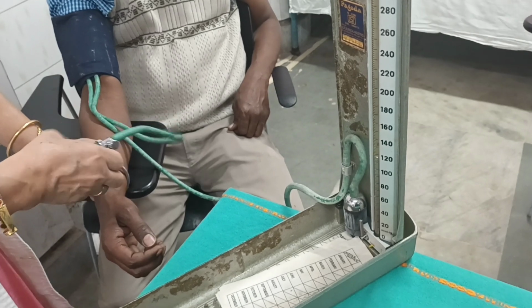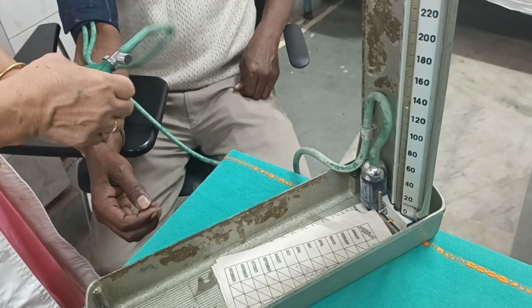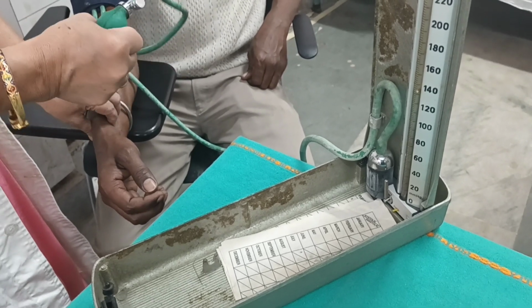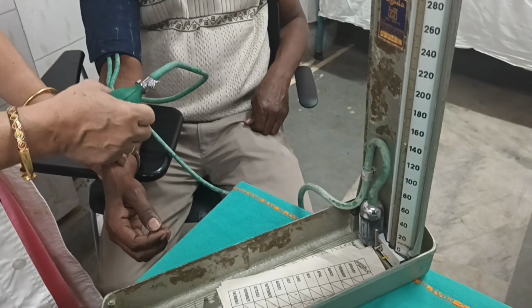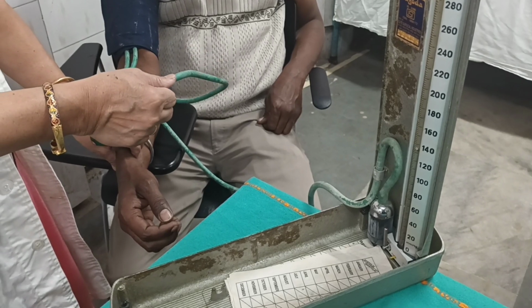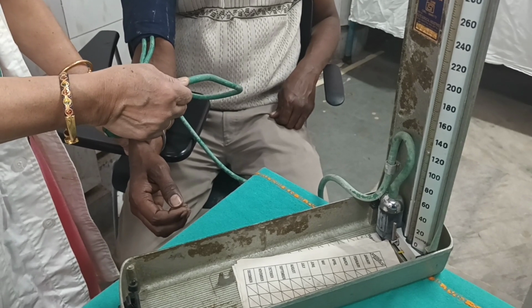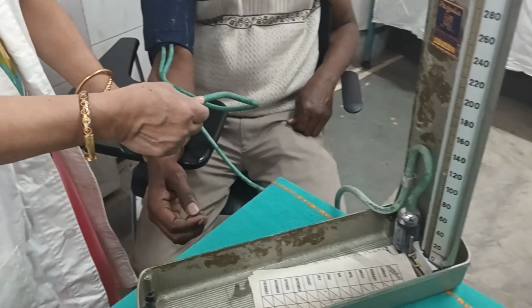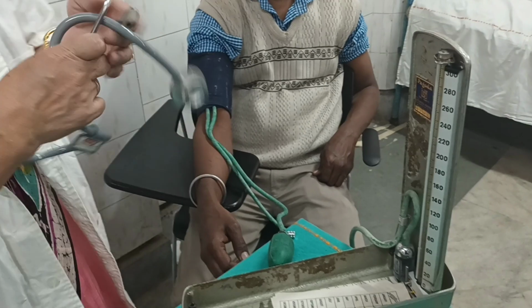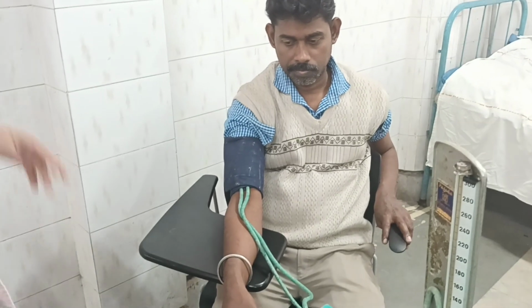Now I am deflating. To be on the safer side, raise it 10 to 20 millimeter mercury more than the disappearance. First note the disappearance of the pulse, then raise the mercury column 10 to 20 millimeter mercury more than that, to be on the safer side. Now deflate it gradually at the rate of 2 to 3 millimeter per second, until you feel the pulse again. Now I got it at the level of 110 millimeter of mercury. So SBP in the palpatory method will be 110 millimeter of mercury.